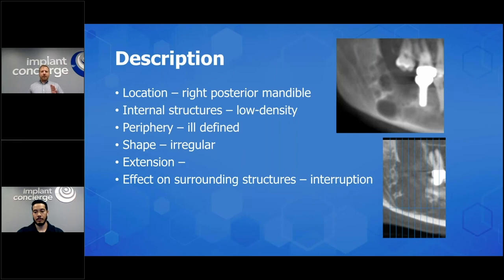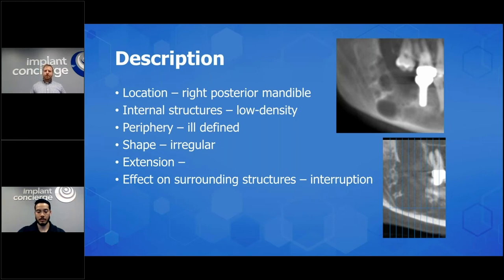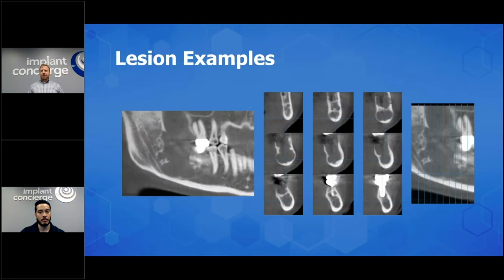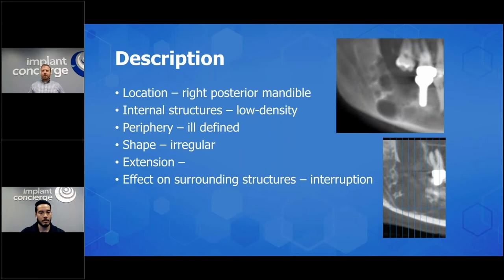Let's slow down so you had a chance to look at the image. So, my findings: location — right posterior mandible; internal structure — low density; periphery — ill-defined, not corticated, it looks like it's messing with all the bone around it; the shape — irregular. The biggest finding was the effect on surrounding structures: the bone is interrupted and perforated. We did not see a significant expansion. Look at those cortical outlines — they're non-uniformly thinned. So there's something potentially bad going on here.